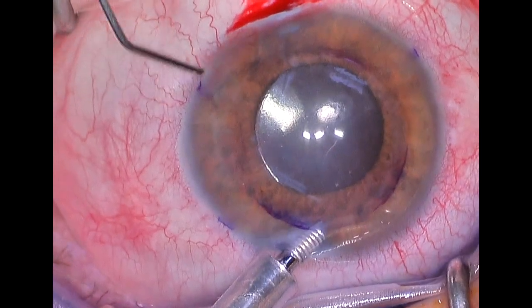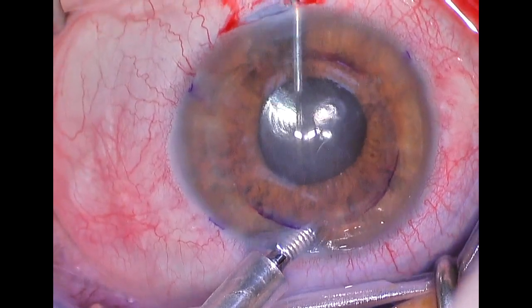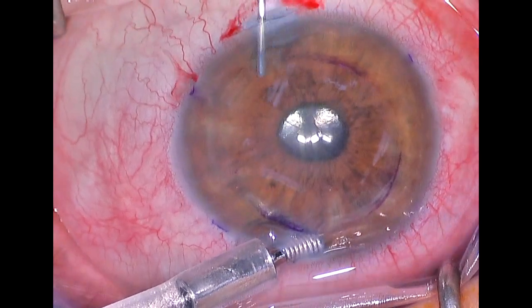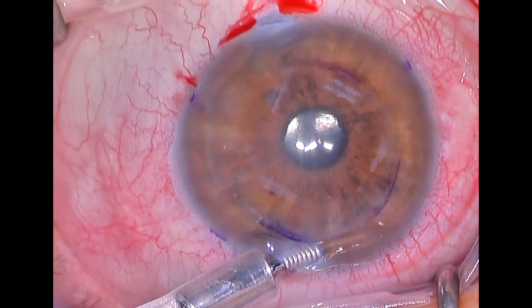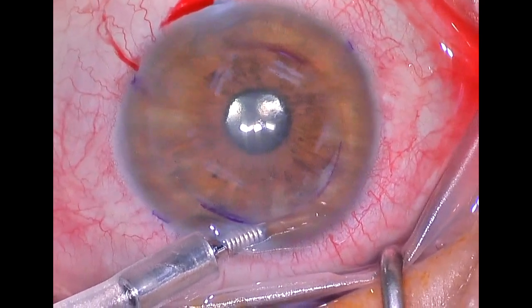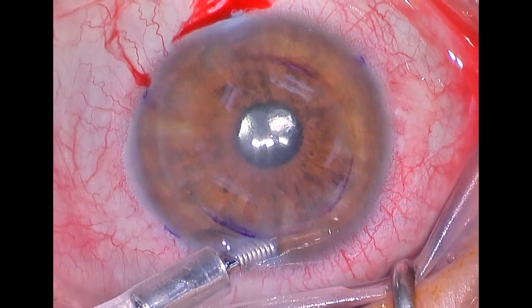The next step is to bring the pupil down. We use Miochol to mios the pupil, or constrict the pupil. The reason for that is that once we put our new graft or new endothelial tissue in place, we don't want it to go anywhere except the front of the eye. If the pupil is large, the graft can slip behind the pupil and become difficult to manage. Now that the pupil is small, we're ready for our graft implantation.